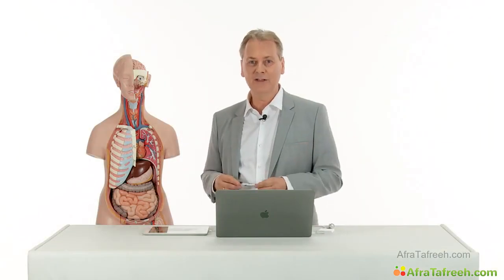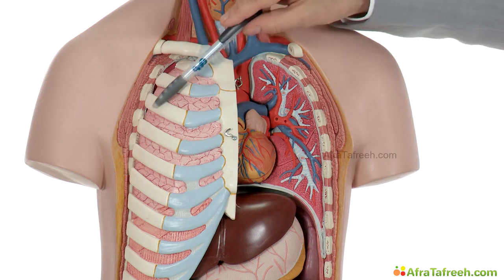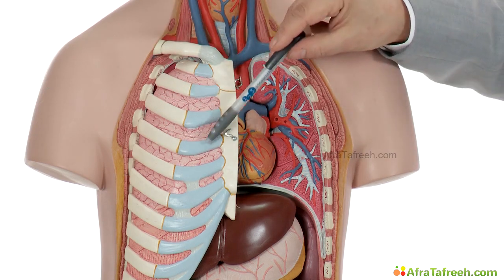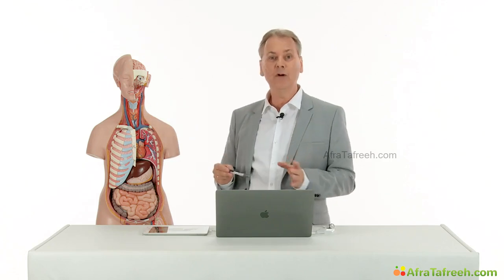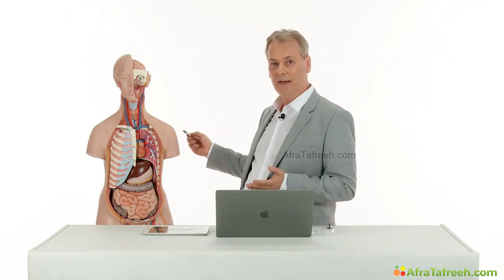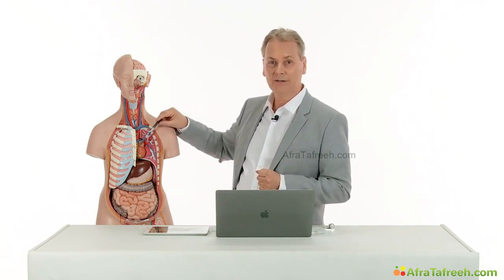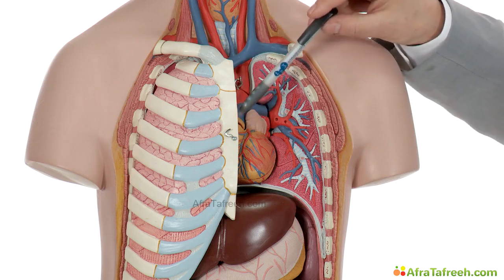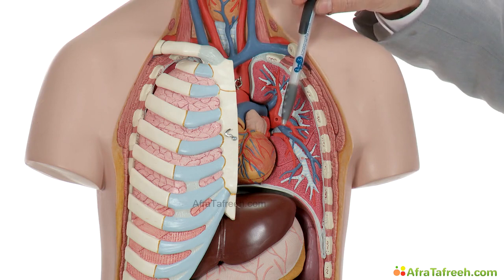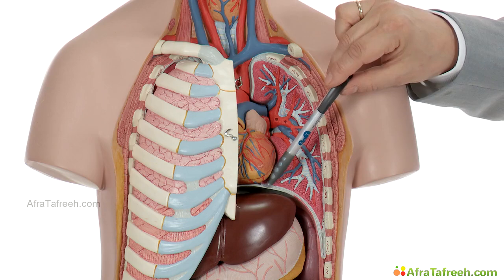The lung is obviously located within the rib cage. Now, the ribs themselves are a barrier to ultrasound. Nevertheless, we have the intercostal spaces from where we can nicely see the lung, no matter if we image from the front, from the side, or from the back. In the middle of the chest is the heart. This is the structure which borders the lung, both the right and the left lung. And then we have the diaphragm, which is the caudal border of the lung.